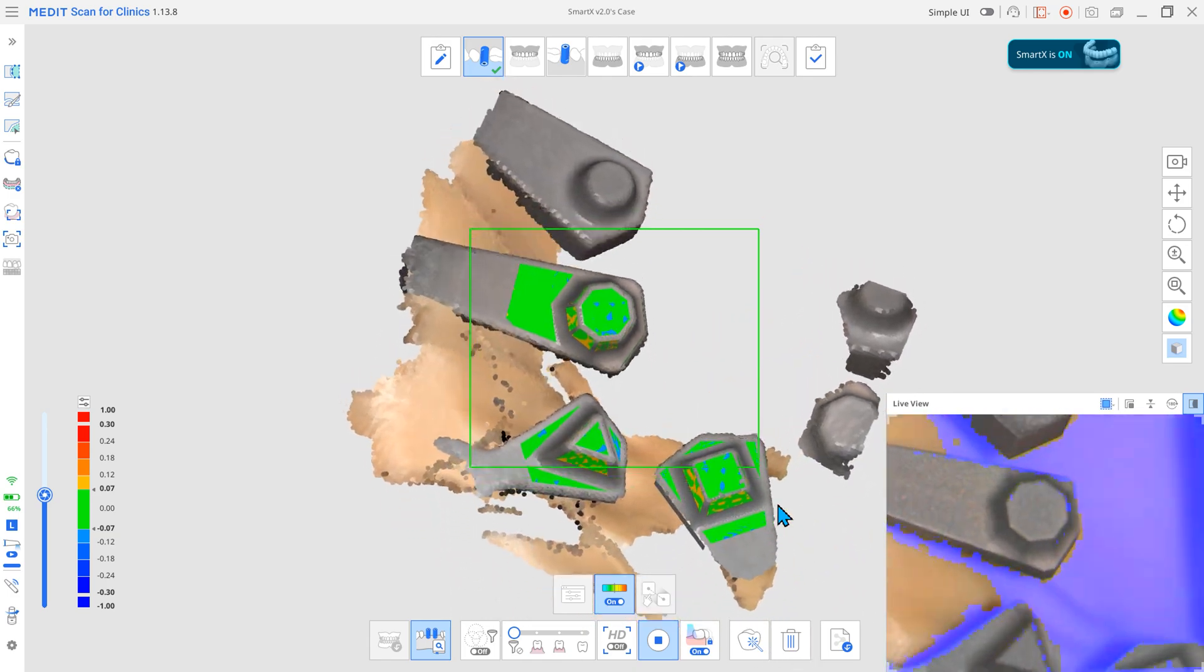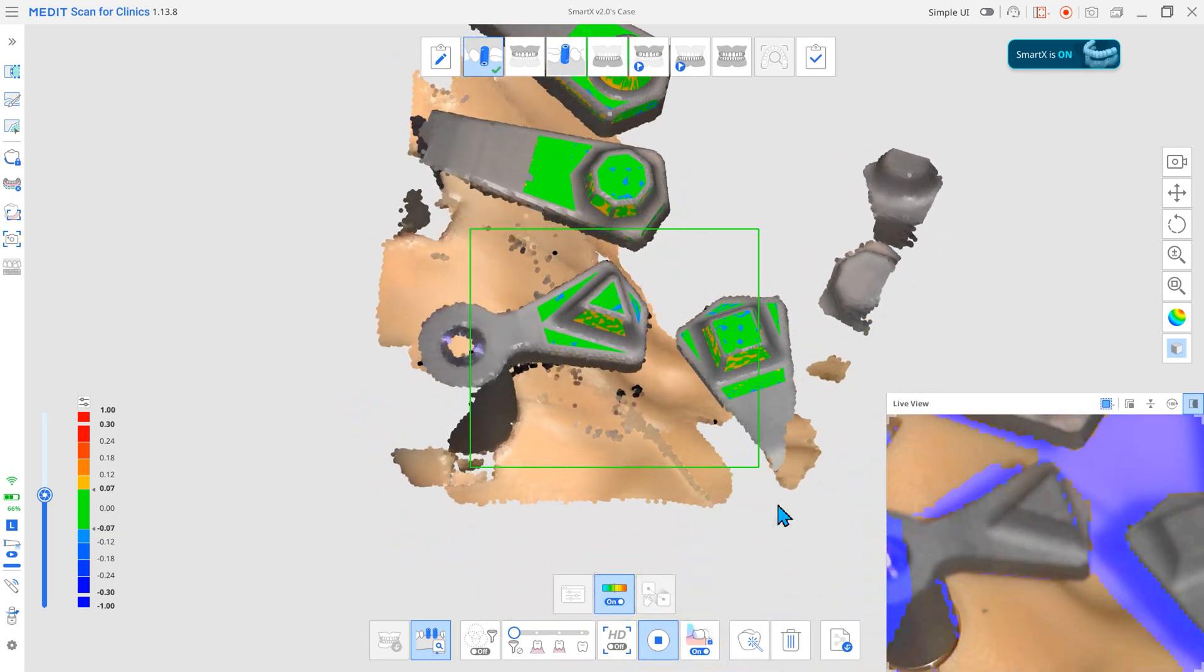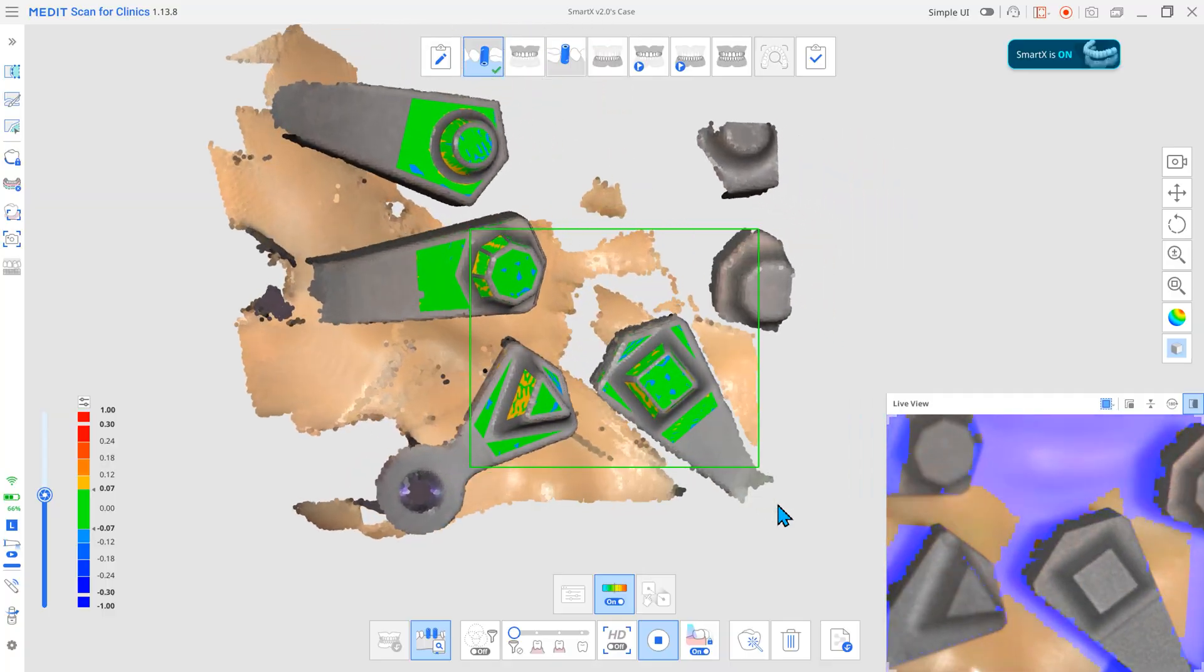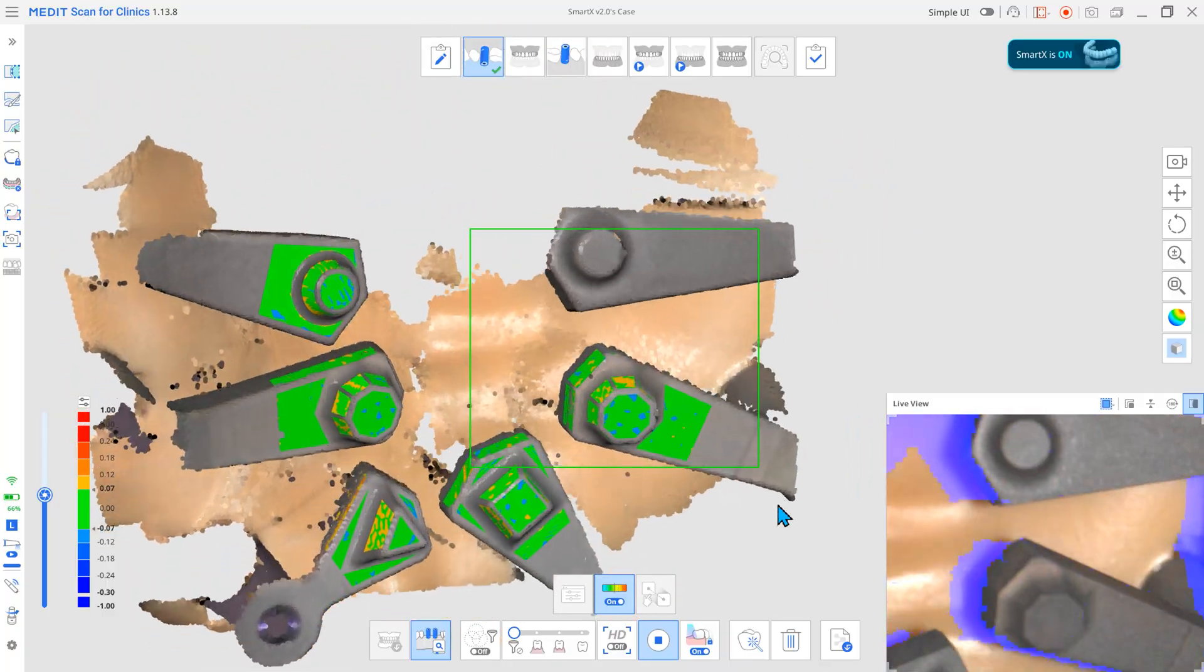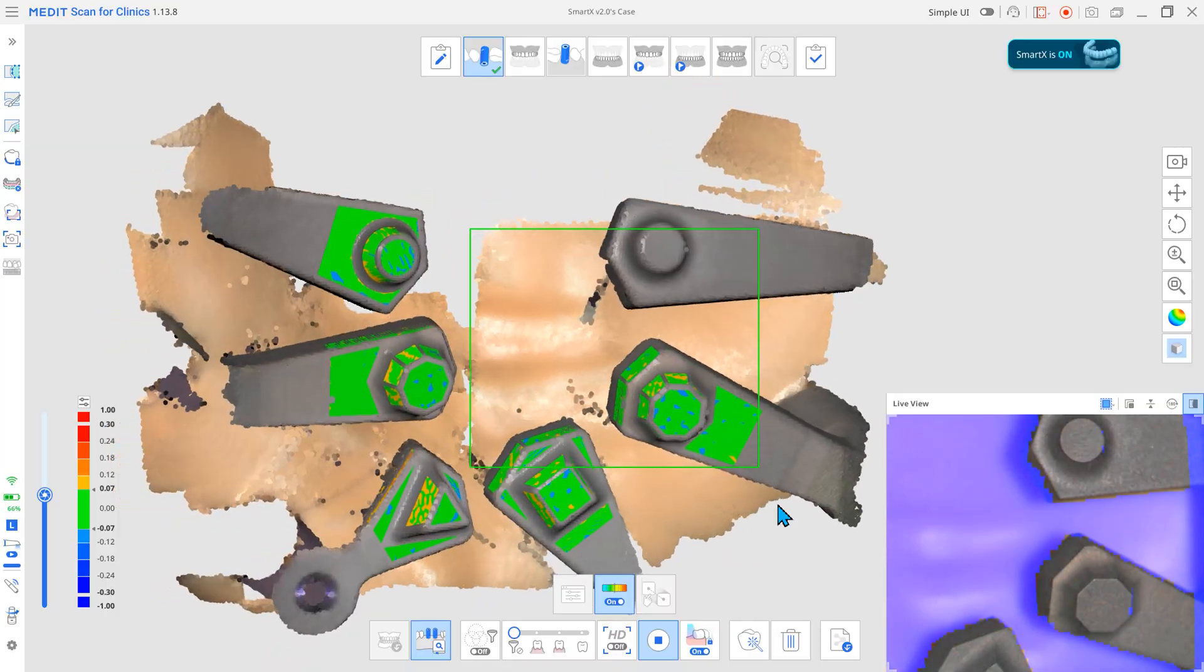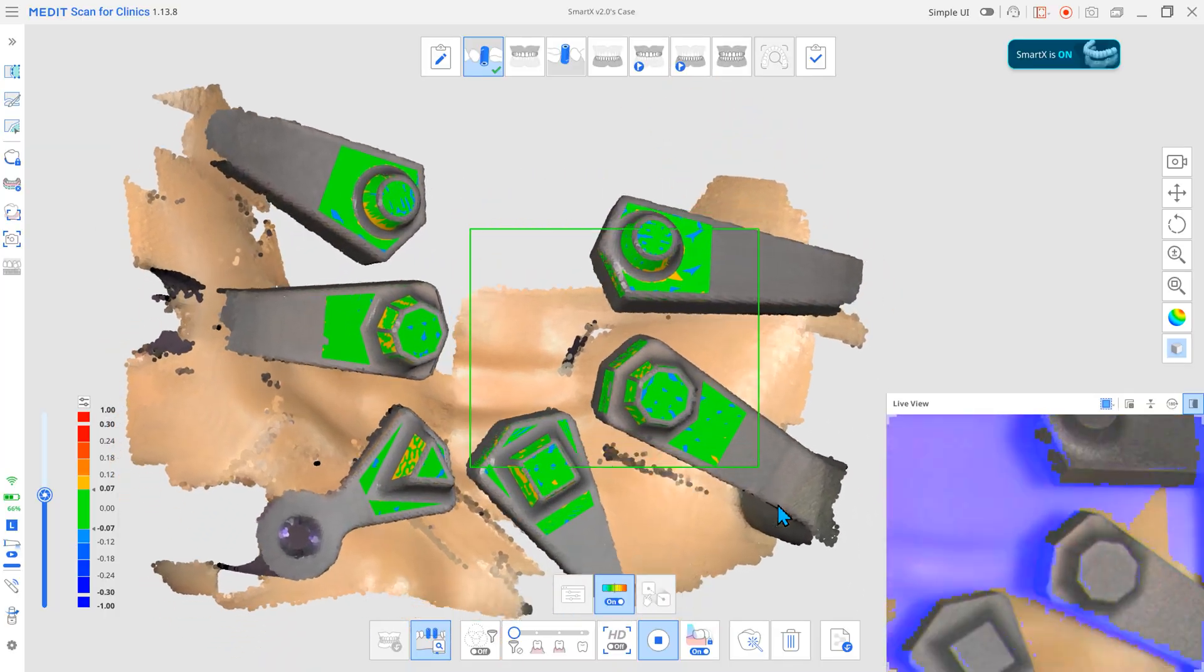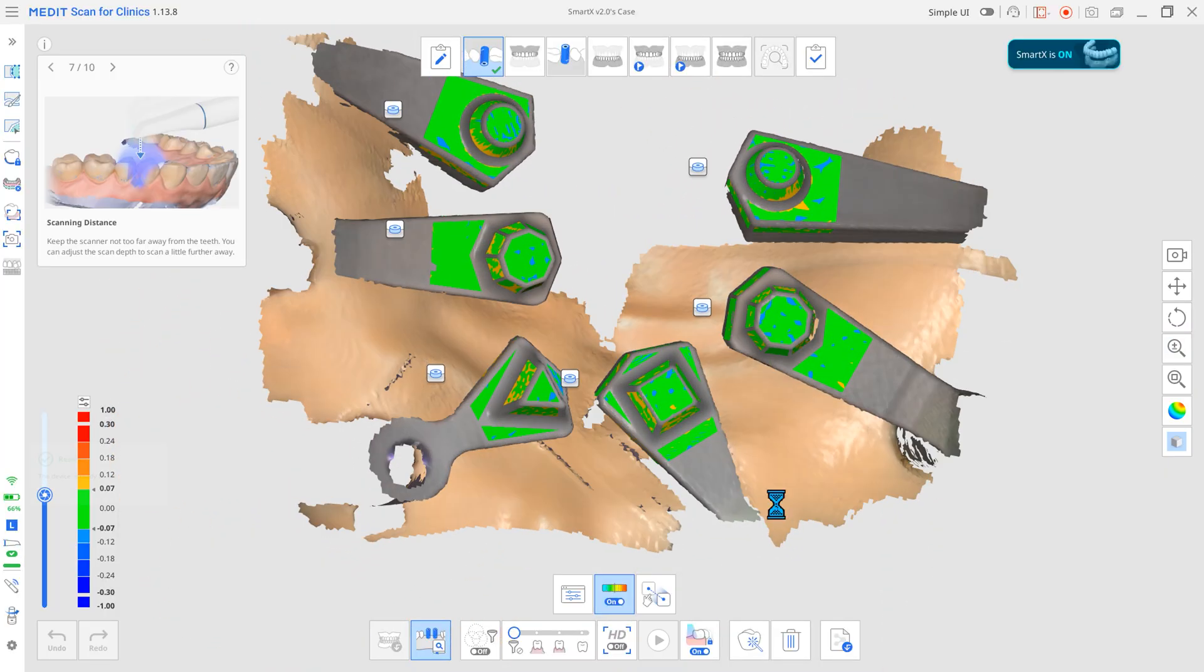As scanning progresses, the program automatically aligns the library in real-time. The color map shows the deviation between aligned data, so you can immediately verify the alignment.